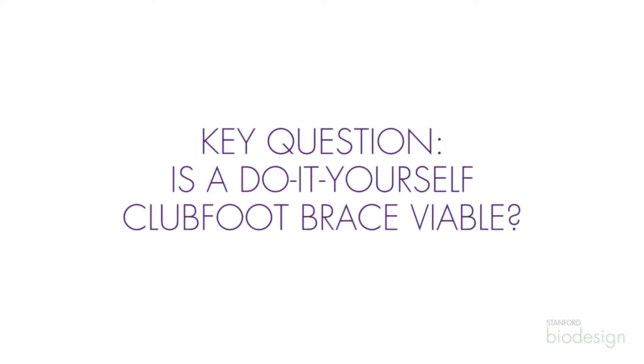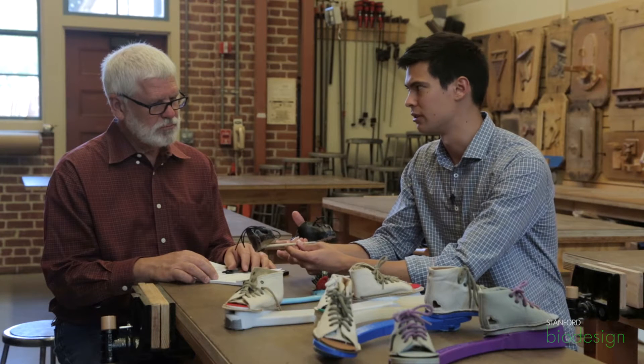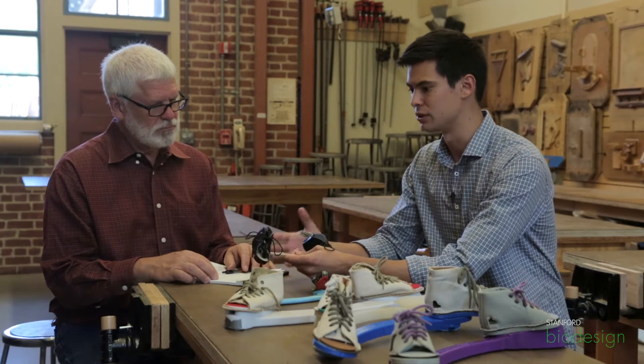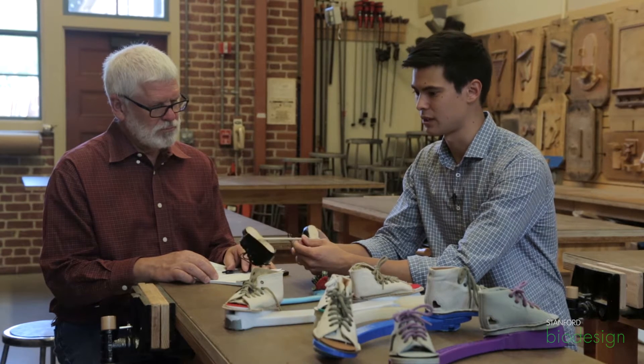Talk about this first one here, the one made out of wood. So this is a pretty early prototype that we made, obviously very low res. The question we were trying to answer with this was, what would it be like to make your own clubfoot brace? What if we had some sort of a manual, do-it-yourself clubfoot brace type solution? And so this was our first stab at that, and it was really just kind of an experiential prototype for us.